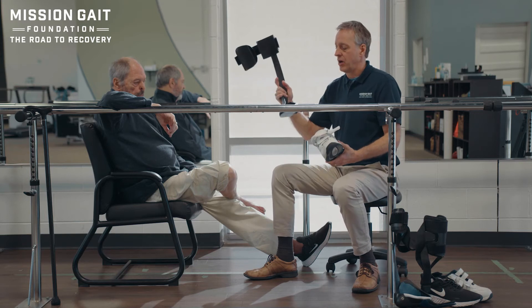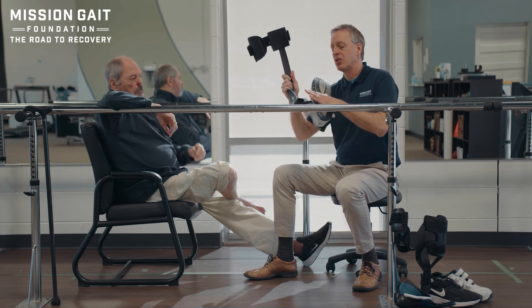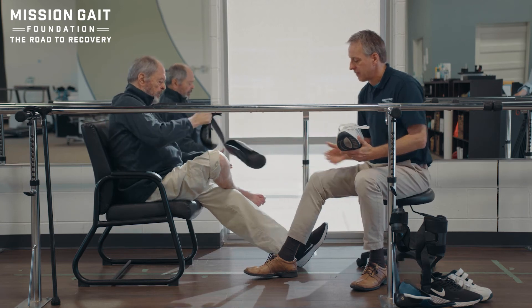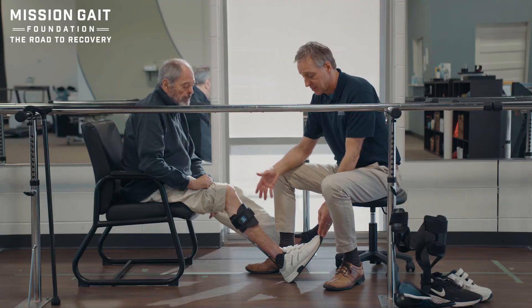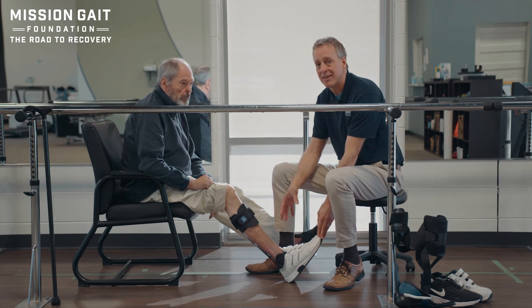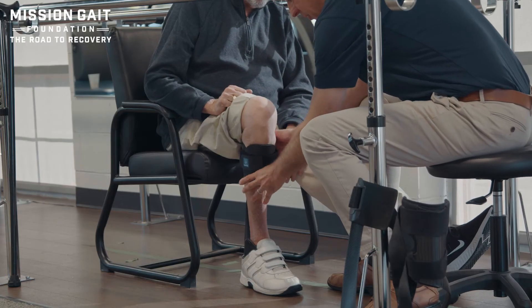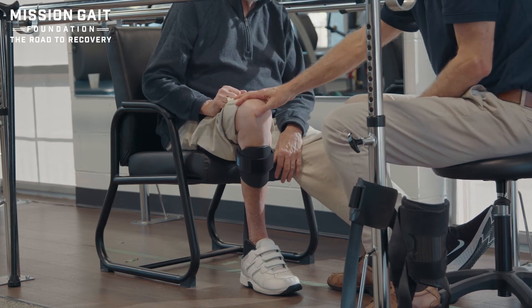In this style of brace - a stiffer brace with a boot - a patient is normally going to don this first and then step into the shoe, versus putting the two together and sliding on. We also talk with patients about buying shoes that are maybe a half size longer and even a width size wider to make sure there's enough room without any impinging or pinching on the toes. Once stabilized in a neutral position with a stable surface and a locked-in front plate, we have full upright stabilization of his leg.